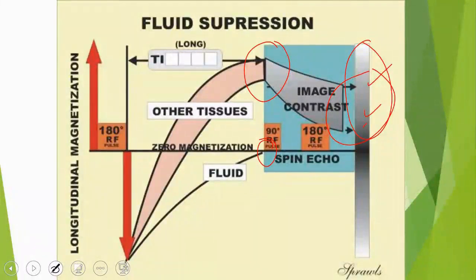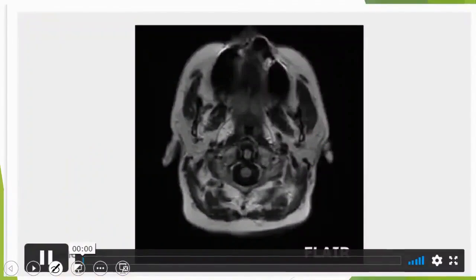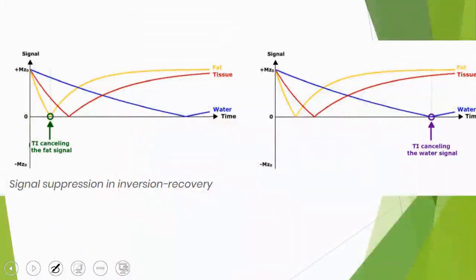In this case, you are continuously gaining more information. We are continuously obtaining information, as every sequence provides you with data that you can use to understand different tissues and the various pathologies present in the MRI. The same applies here.